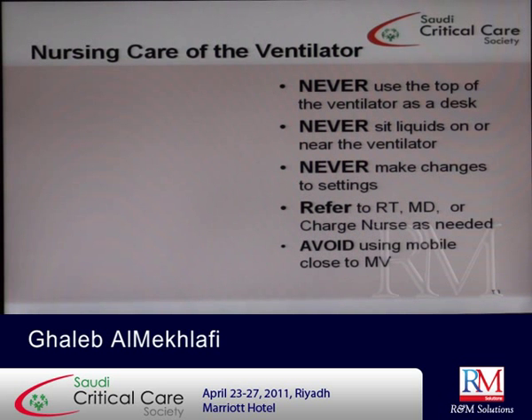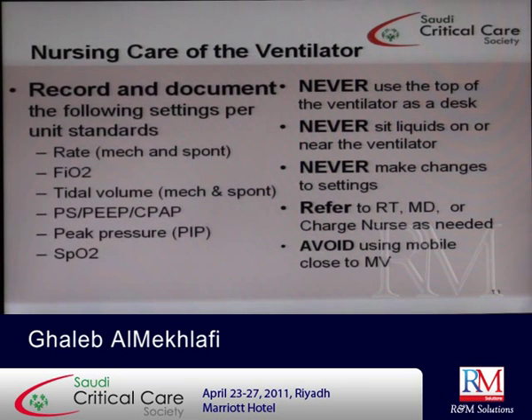Also, you have to avoid using a mobile phone close to the mechanical ventilator. There is a recent study stating that if you use a mobile phone within about 3 feet of the ventilator, it can affect the function of the ventilator. You also have to record and document the following settings per unit: mode, rate, FiO2, tidal volume, pressure support, PEEP, CPAP, peak pressure, and SpO2 in a timely manner.